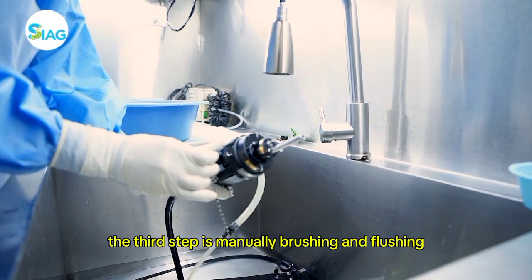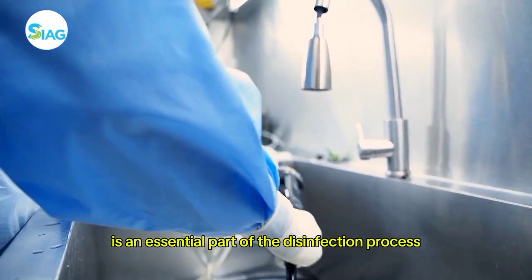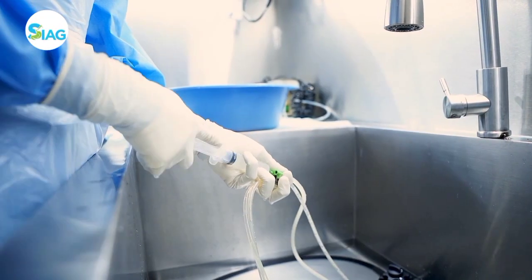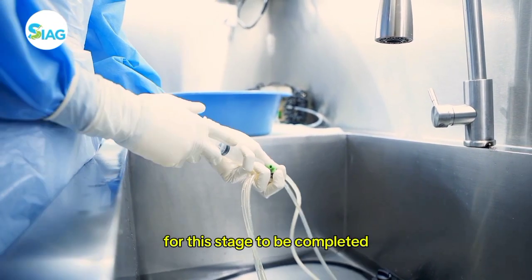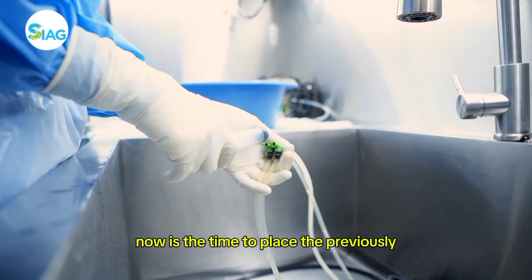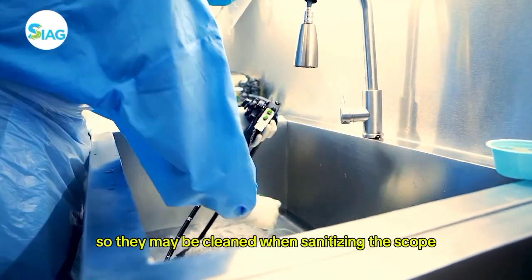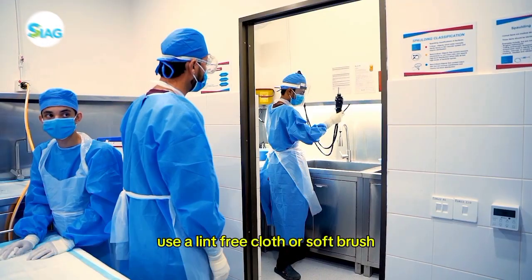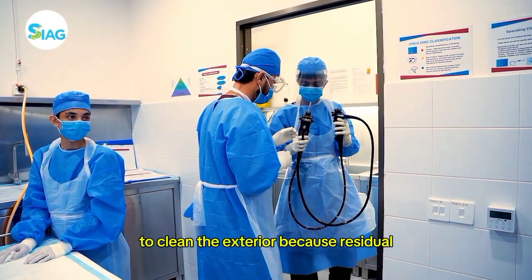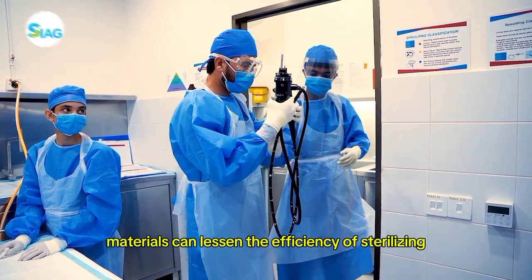The third step is manually brushing and flushing. Cleaning the scope manually is an essential part of the disinfection process. The scope needs to be fully submerged in the detergent for this stage to be completed. Now is the time to place the previously separated parts into the container so they may be cleaned. When sanitizing the scope, use a lint-free cloth or soft brush to clean the exterior.